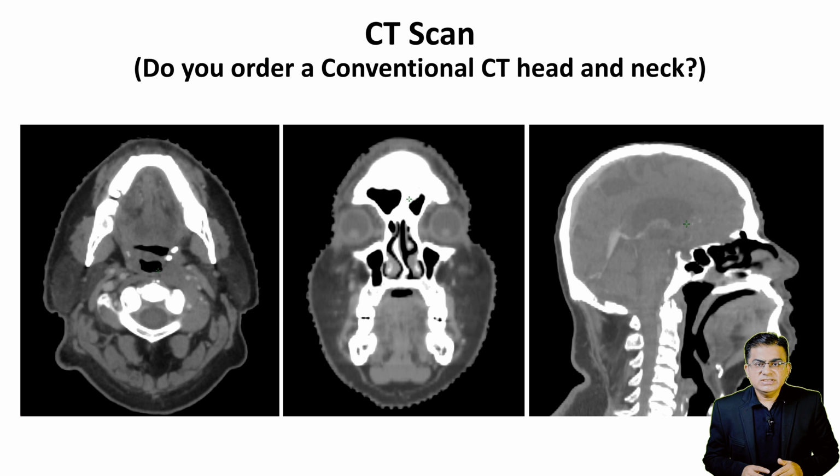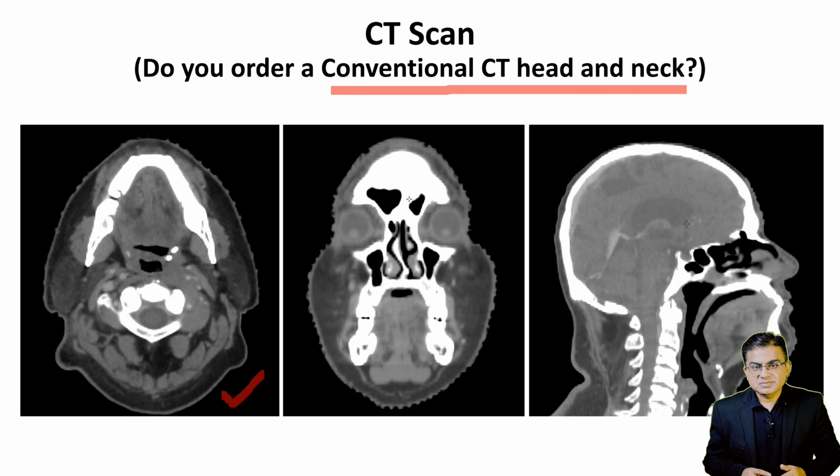Very often, we just order a CT face and neck, a conventional CECT, and accept whatever images we get from the radiology department. Recall, what have you been doing so far? Do you know when your radiology technician takes a CT scan of your patient, what protocol he follows? I'm sure many of them take a contrast enhanced CT scan of the head and neck region in axial slices in soft tissue window. You have been doing wrong all these years.